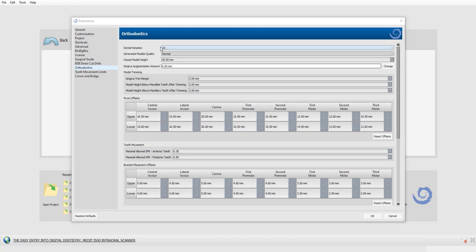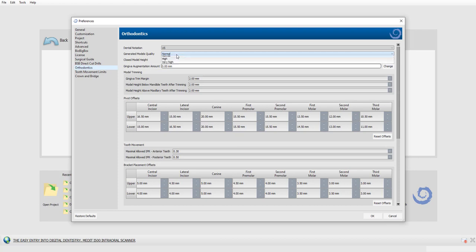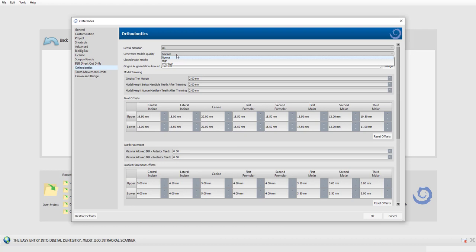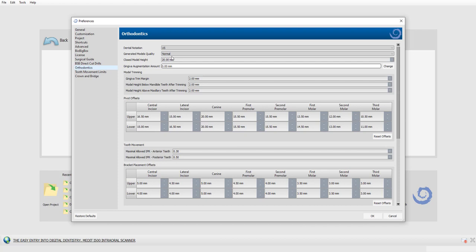The first settings we have here are dental notation — by default it's set to United States dental notation tooth numbering, but you have the ability to change that to the European numbering system. You also have generated model quality for thermoform aligner models. You could keep it on normal. If you want to increase the resolution — which increases the size of the exported files — you could change it to high or very high. Normal is perfectly fine.